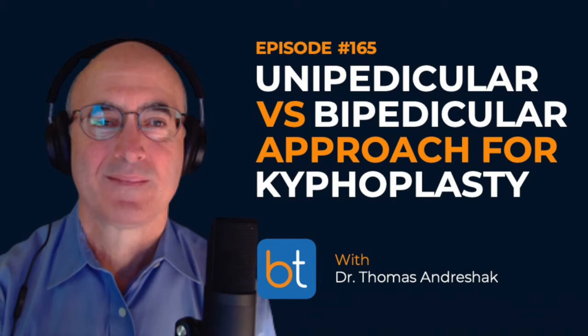It's interesting. In my last job, I was at least 90% kyphoplasty. I would occasionally, as you said, for an older looking fracture. And for me, sometimes vertebra plana, where I'm nervous about inflating a balloon there, I'll sometimes just go with cement. But I joined a new practice here, and it was a group that did exclusively vertebroplasty. There was a guy who didn't really believe in using the balloons. And so that was a battle I had in my first year here. I still am a believer.